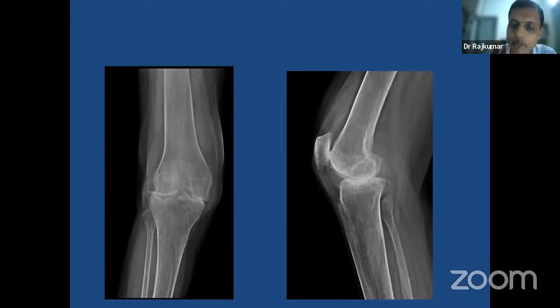So two things you can do if you find this situation. First thing is try to release the hamstring. You can do the TKR and then do the hamstring release subsequently, or before painting itself, take a knife, do the hamstring release, and then go ahead and do the procedure. And don't take too much bone from the distal femur. Keep it minimal. Do the cuts. Do extensive release posteriorly, capsular release. And 5 degrees of residual FFD, you can leave it.